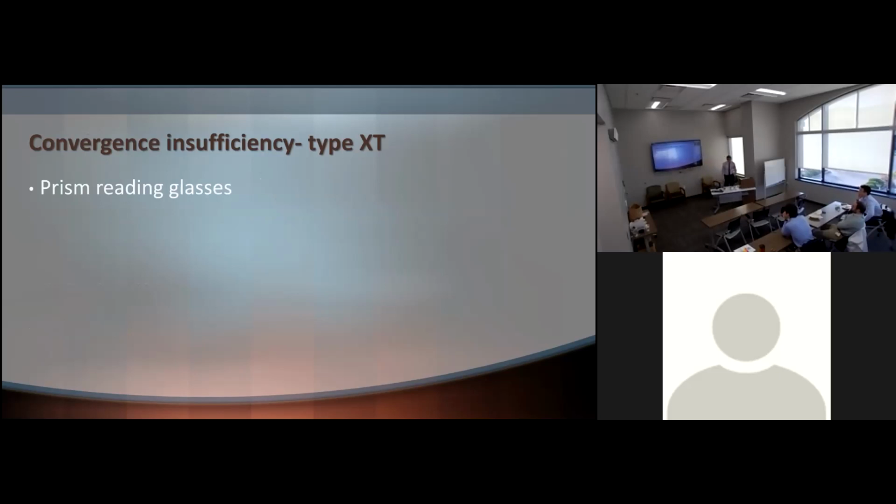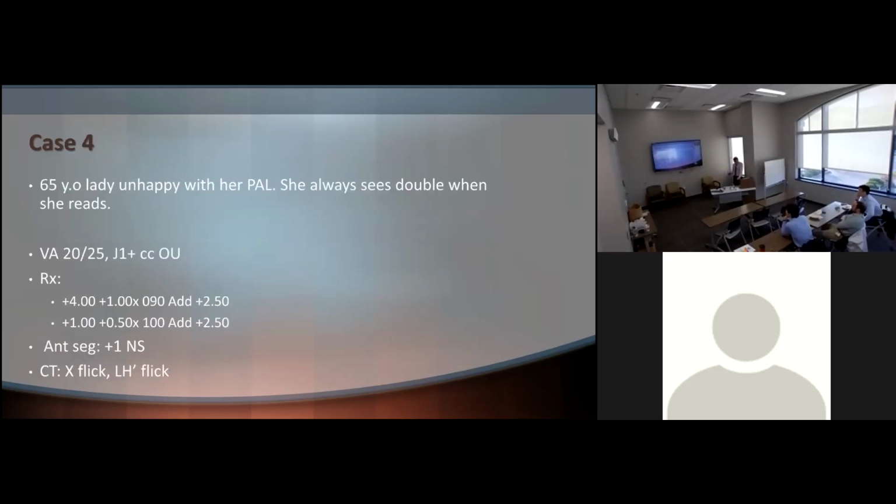Okay? So this patient is old enough with multiple concussions. There is weakness in the mechanism of convergence centrally in the brain, and he's heading to presbyopia age, and there is no way that we can train his convergence. So we need to alleviate his or her symptoms. So we're going to prescribe prism glasses. What direction is the prism going to be? It's in. Perfect. Because we gave up on convergence, we need to alleviate symptoms at this point. So we're going to divert the image toward the apex, toward the patient's deviation, and do base in reading glasses. Okay?